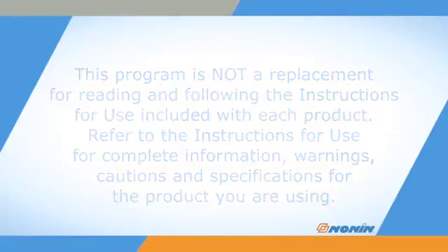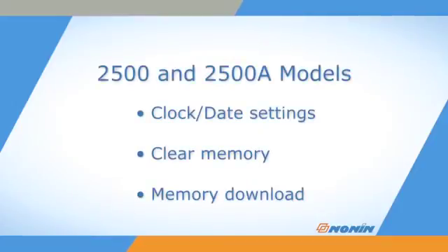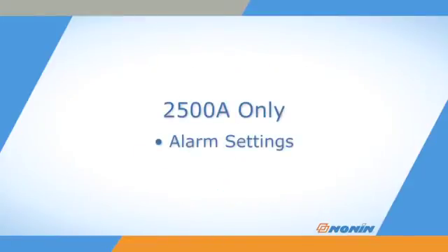On both the 2500 and 2500A models, Setup Mode is used to set or disable the clock and calendar, clear the oximeter's memory, and perform memory download. On the 2500A model only, Setup is also used to adjust alarm settings.